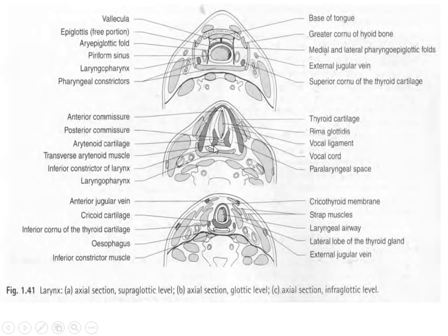At the level of the glottis, we see a continuous cartilage ring from the thyroid cartilage anteriorly and the arytenoid cartilage posteriorly, with the rima glottidis in the middle, and the constrictor muscle of the pharynx. At the infraglottic level, we see the laryngeal airway in the middle, the inferior constrictor muscle of the pharynx behind it, and the thyroid gland lateral to it.